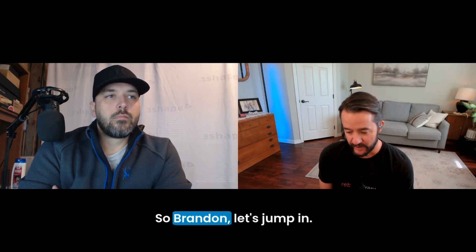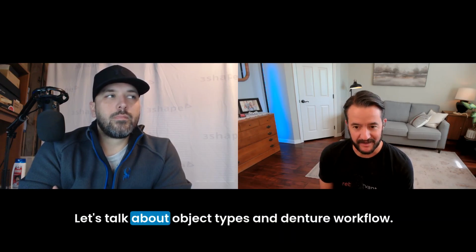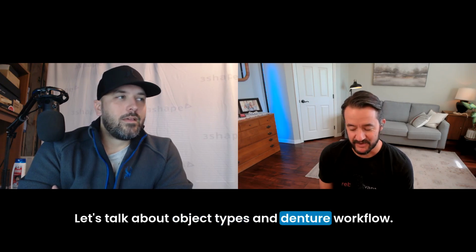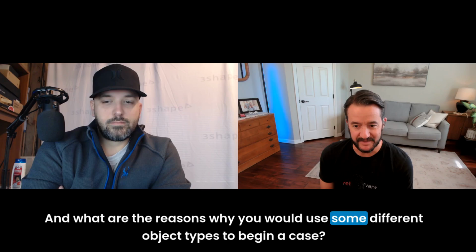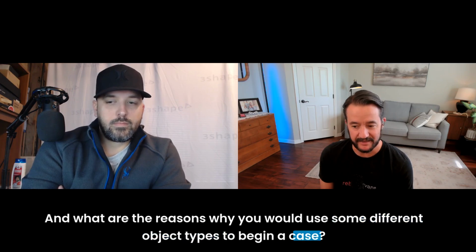So, Brandon, let's jump in. Let's talk about object types in denture workflow and what are the reasons why you would use some different object types to begin a case.